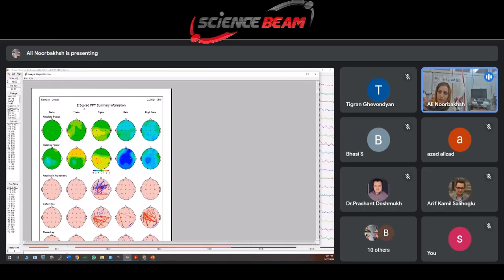Can you remember about this client? Beta is very low. Can you remember? Beta is very low for this person because yesterday we recorded an evaluation. We recorded a signal from this person.